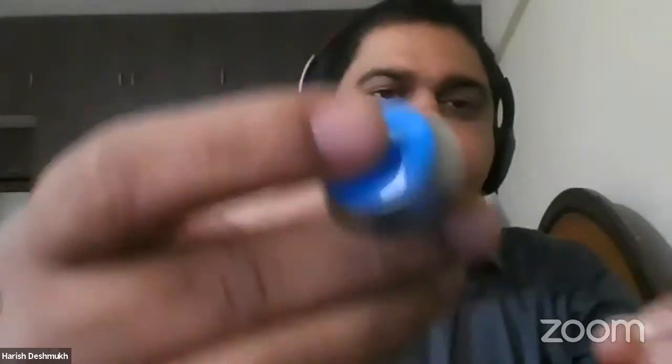So your trocar, there is a sharp trocar which will open up from the rectal stump, and you'll get an orange line. You can see here the orange line. This orange line should be outside the rectal stump. Once it is out, the other end, which is the proximal end with the anvil, will club the two ends. You will again get a click sound here. Then we'll approximate the two ends. After approximating, the two ends will come together.